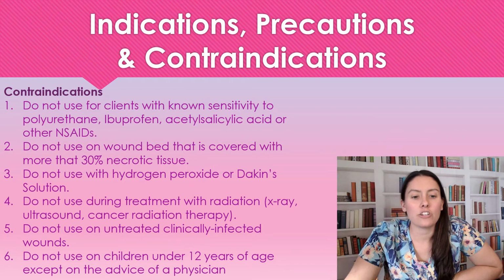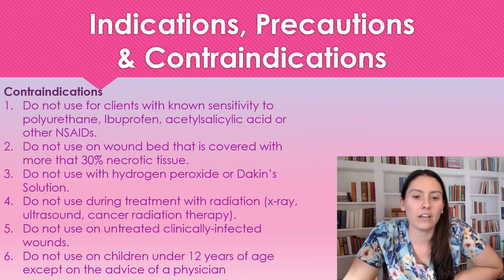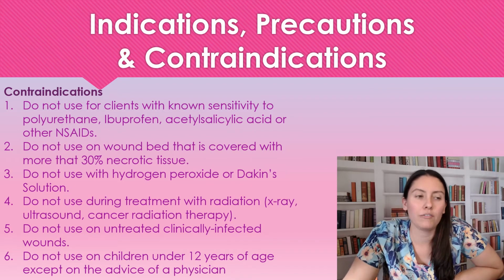For contraindications, we're not going to use this on patients with a known sensitivity to polyurethane, NSAIDs, or ibuprofen. Do not use this on wound bases that have more than 30% necrotic tissue. We're not going to use this with hydrogen peroxide or Dakin's solution. Don't use this if somebody is undergoing radiation therapy. And we're not going to use this for children under 12 years of age unless the doctor has said to do so.